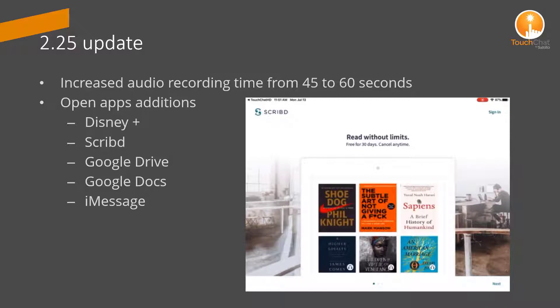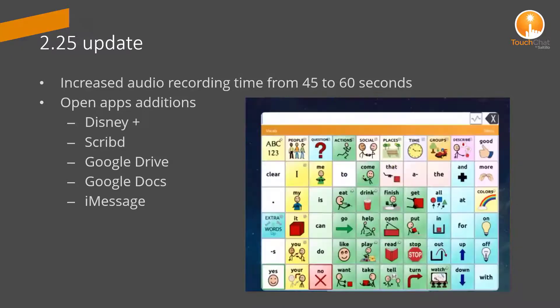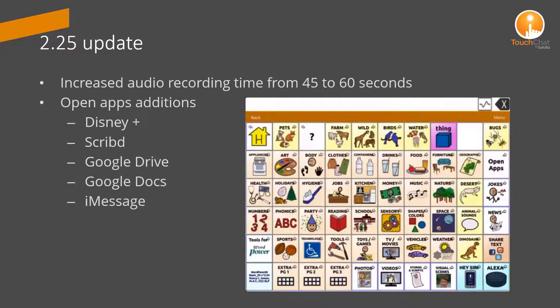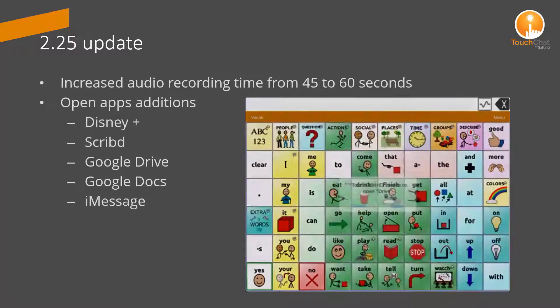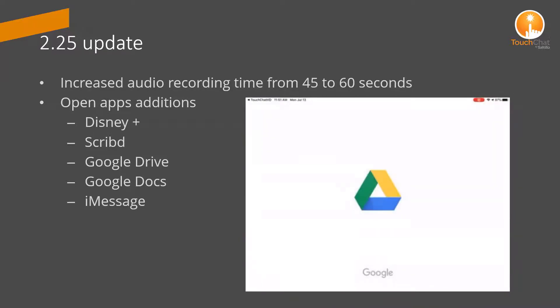The first time you open the app within TouchChat, you will be prompted with a message to allow TouchChat to open the application. To get back to TouchChat, you can swipe from the bottom to access your recent apps and select TouchChat again.